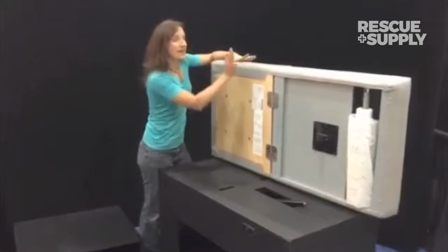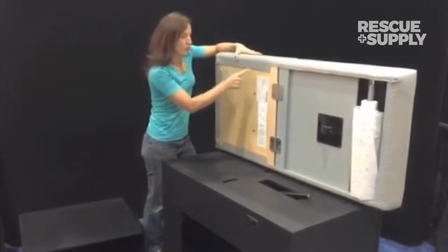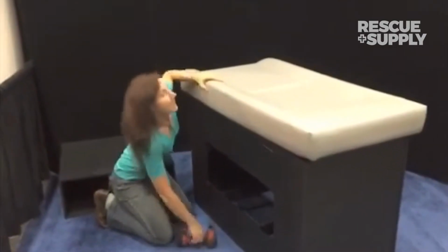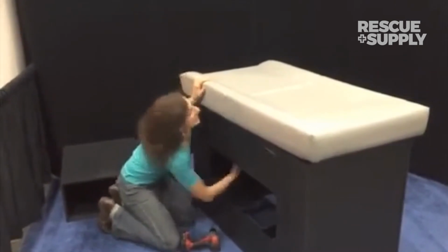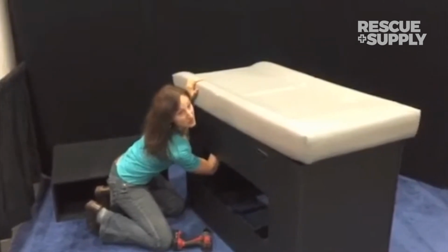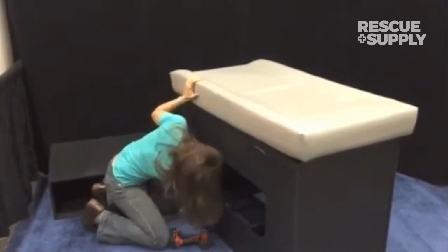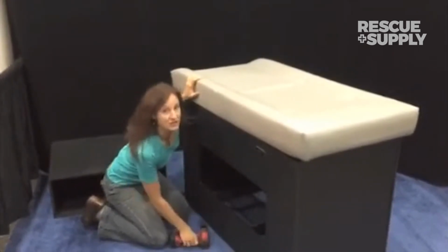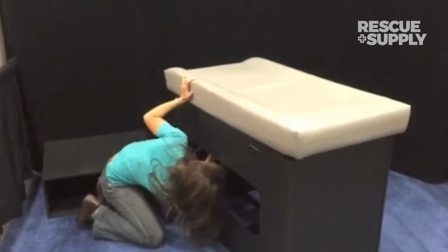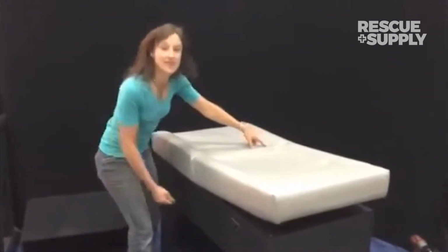Once you get the top on, then you can lift the cushion to the top, and as you notice, there's 4 pre-drilled holes. Set the cushion down, and then reach inside and find the corresponding pre-drilled holes that go through the cushion that we identified on the top. You can get the bolts hand started, and then you can finish them off with the drill. You should have installed 4 bolts through the underside of the table.